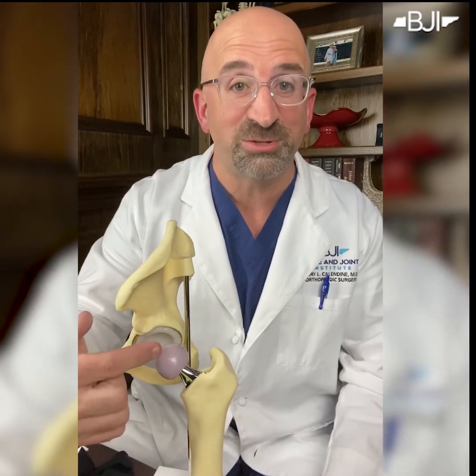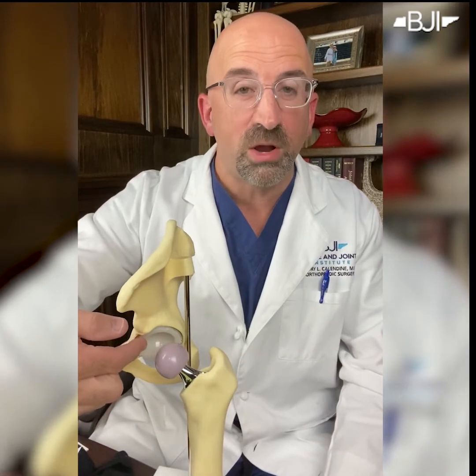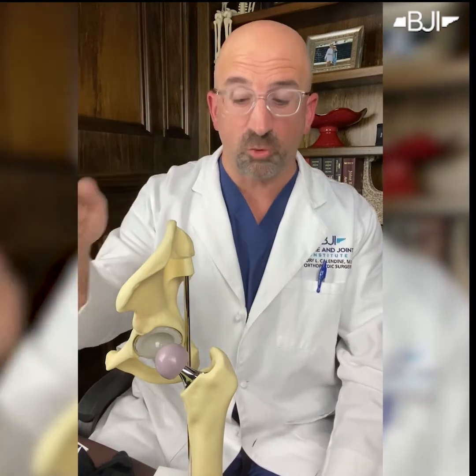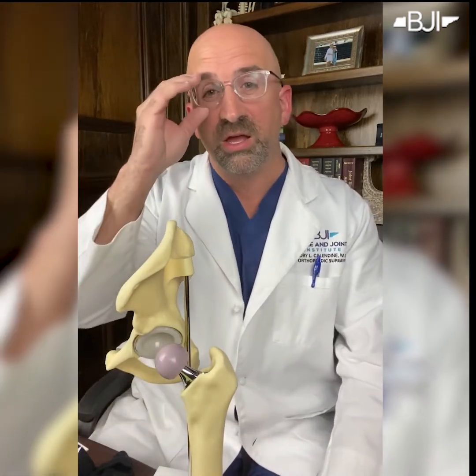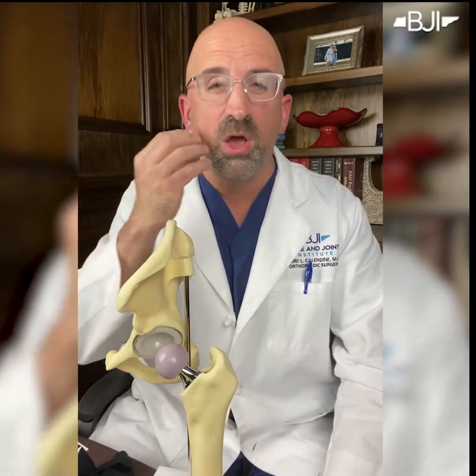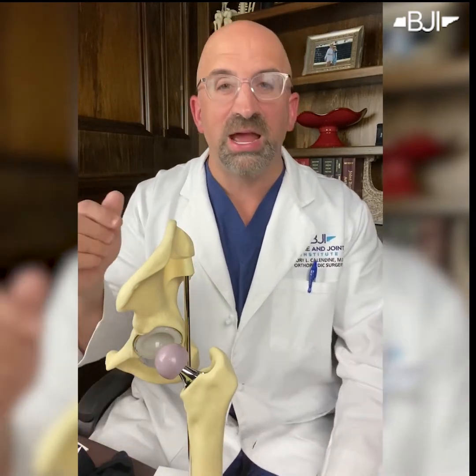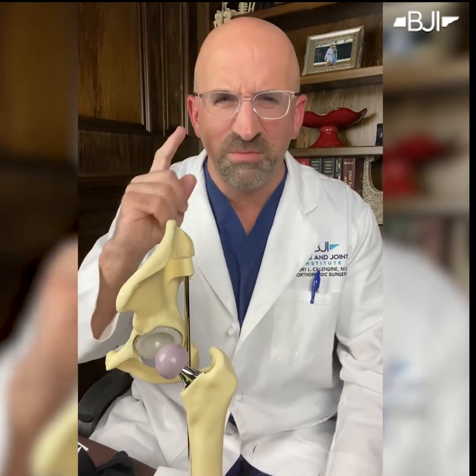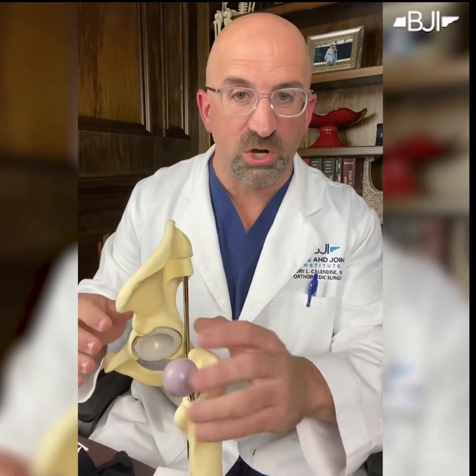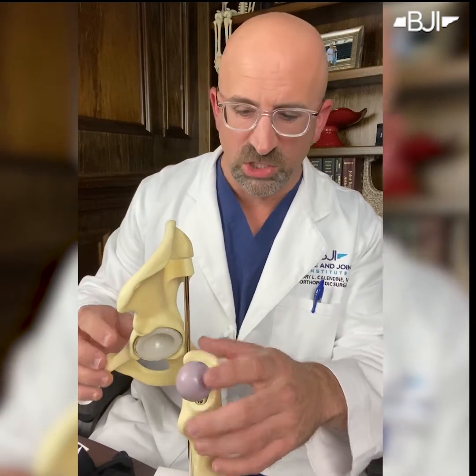So that's the thigh bone part, the femoral component. You can see on top of that there's a ball and this one's pink — I'll explain that in a second. Now the ball rubs up against the liner, but the ball can be made out of metal or it can be made out of ceramic. This one is a pink color indicating a ceramic head ball. Most of the ceramic head balls that we use are a certain type of ceramic called delta ceramic, and they are in fact pink. I might mention that to my female patients, but I don't mention that to my male patients, even though it's true. So we have those two parts: the metal piece in the femur and the head ball on top, which can be metal or in this case, ceramic.